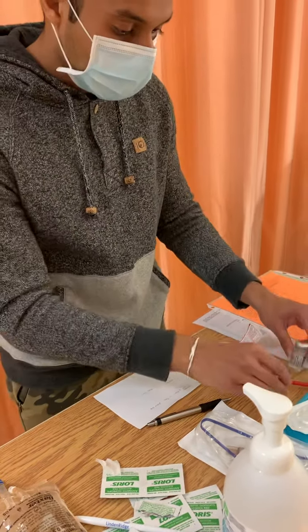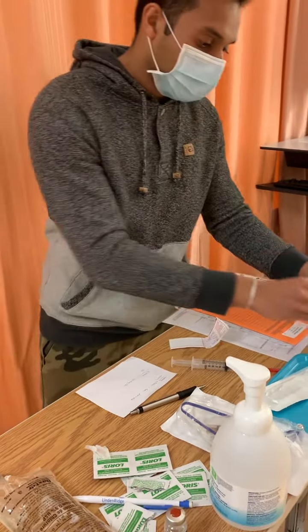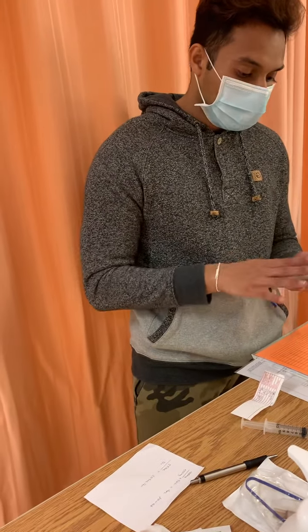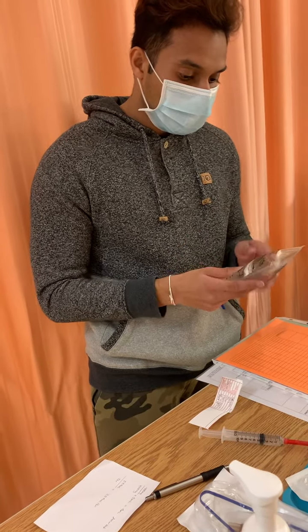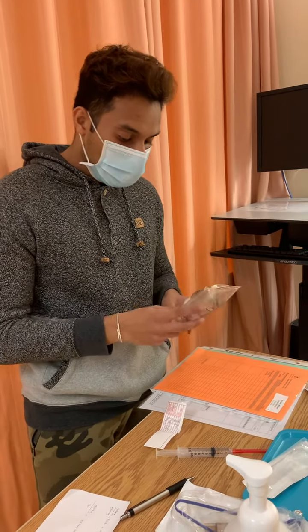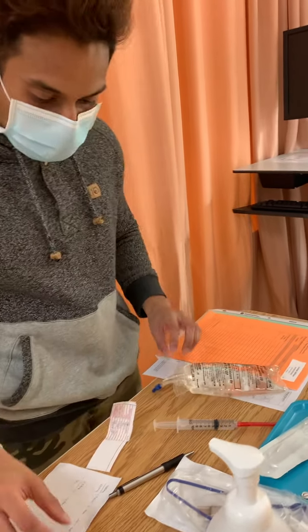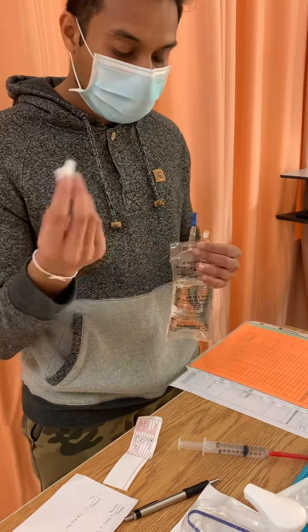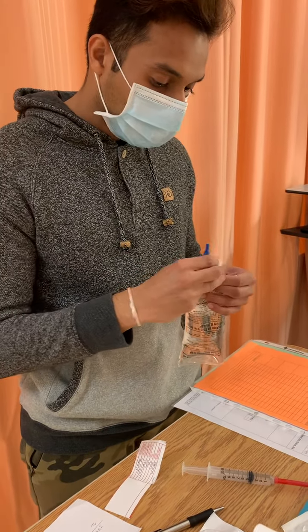So we're just going to get rid of these vials in the med waste and throw them in the garbage because we don't need them anymore. So I'm going to grab our mini bag. This is a new mini bag. It's intact. It's not expired. It's 250 mLs of normal saline. It's compatible with our primary. And this is compatible with the medication as we saw in the parenteral drug book. We're going to swab it for 30 seconds with the new alcohol swab, and let it dry for 15.